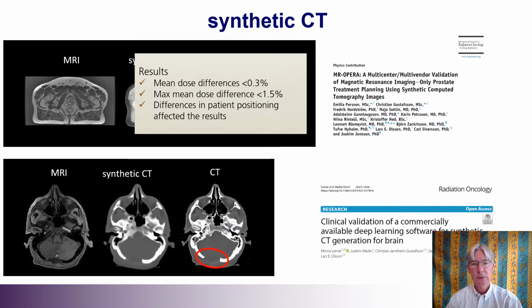Recently, we have also started with synthetic CT of the skull in collaboration with Spectronic, and you can see one example here where actually the effects of surgery are quite evident, and the synthetic CT is depicting that area very nicely.